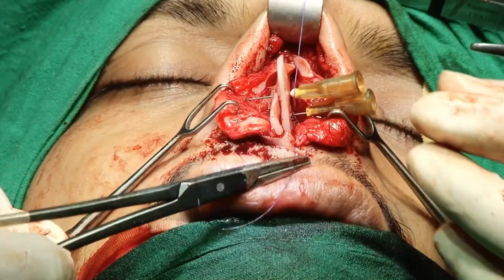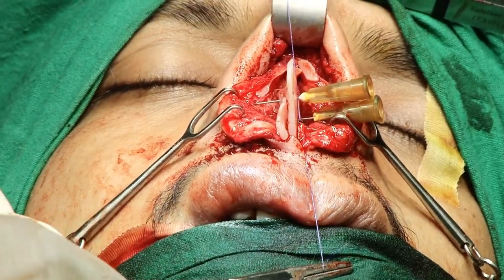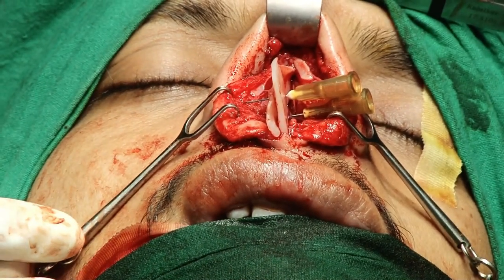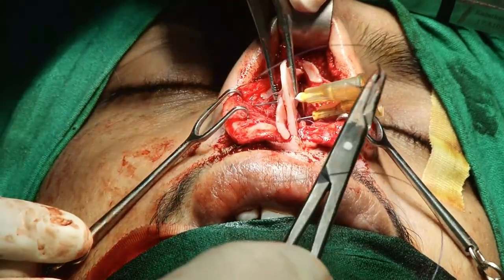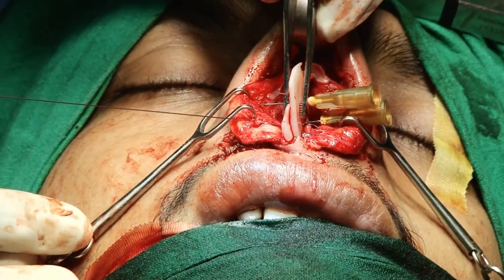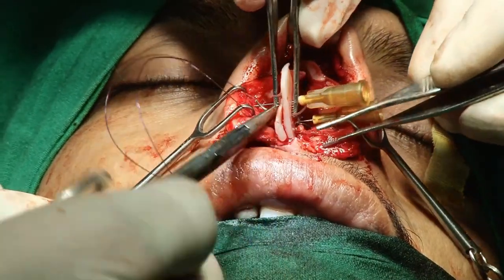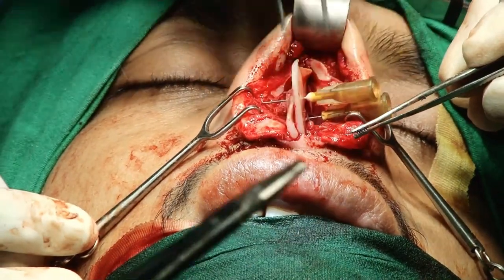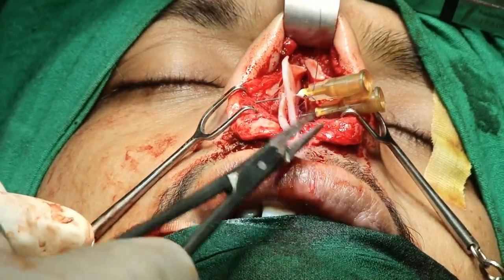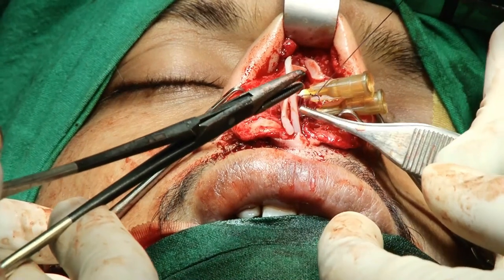Each case has a different way of correcting it, and you have to use a graduated approach. Sometimes when you put the graft and cut it, you check the effect of that graft, and if you don't feel comfortable, you change it, using whatever amount is available. Sometimes when you don't have an adequate amount of cartilage, you can use this PDS plate, making a hole with the piezo and a needle just as a pattern. So this is basically a horizontal mattress suture.